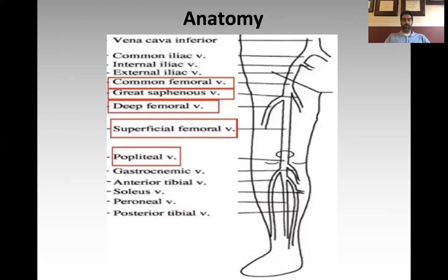Here is the right lower extremity, and the pertinent anatomical landmarks, excuse me, are in the red boxes. As you'll see, we start with the common femoral vein. And as we go down the femoral vein, we want to identify certain high yield points, which tend to be branch points or tributary inlet points. And these are points where you are most likely to form clots as you go from sort of laminar flow to turbulent flow as velocities change, as flows converge and things like that.